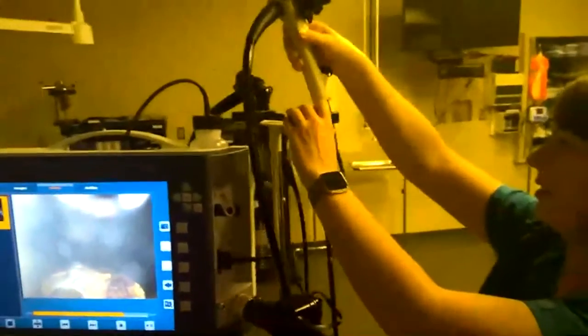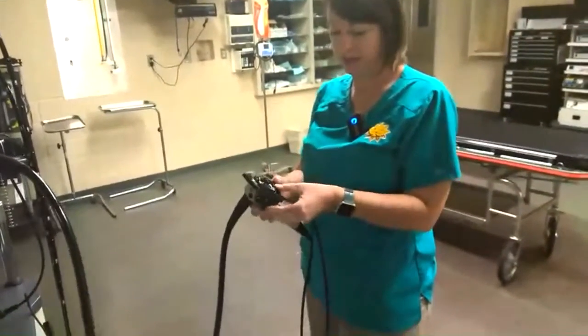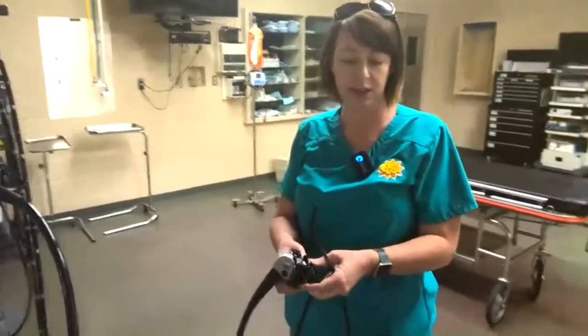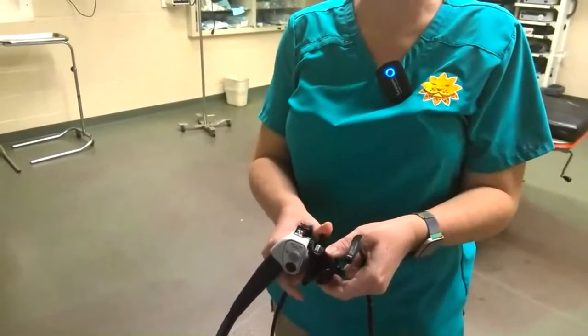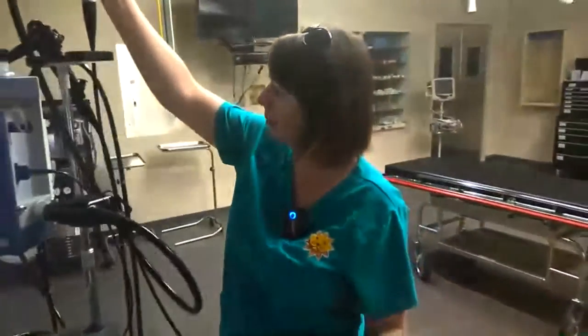This is our endoscope. The doctors will hold on to this part of the machine right here, and this is kind of the driver, and it drives this end, which is the video. So this end will be into the animal, and then the doctors will be moving this, and you can kind of see, I don't know if you can see that on the video, how they have to steer this thing to get a good look around. It moves in all directions, but they can't see it while they're steering it. They have to imagine which direction they're going because this end is down into the animal. So that's pretty fun, some of our endoscopic equipment.